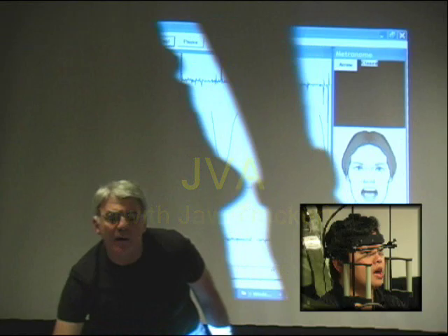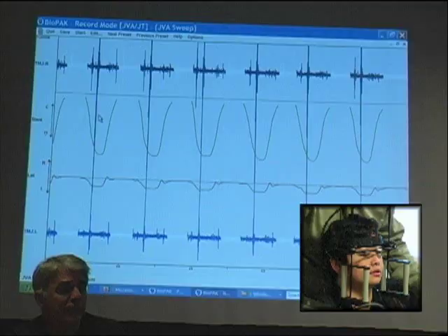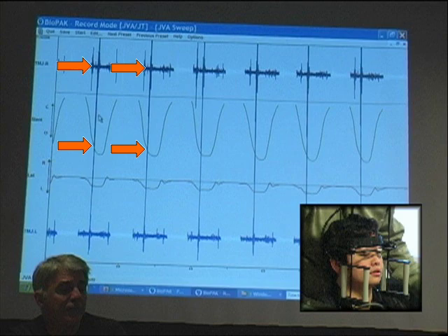Open, tap, open, tap, great. Every time that we open, we get a significant vibration. See it? Right joint, that's where it's occurring.